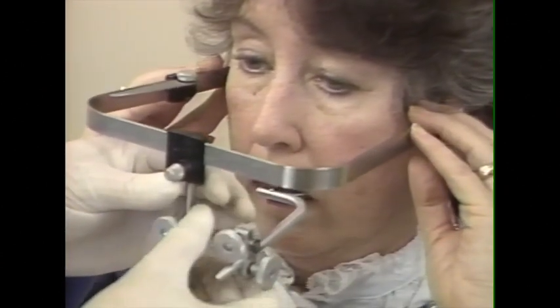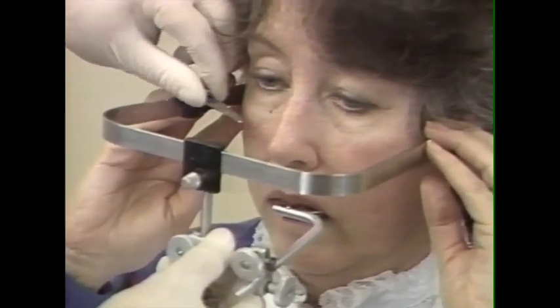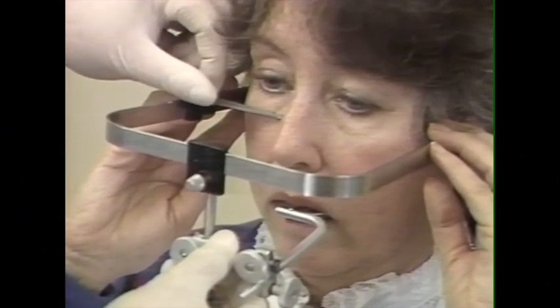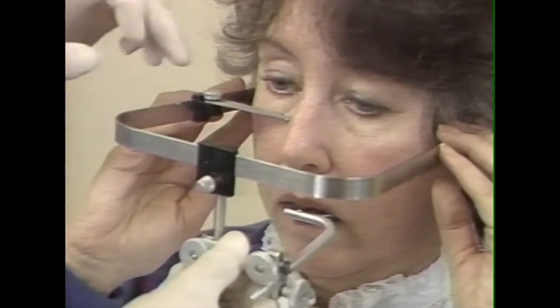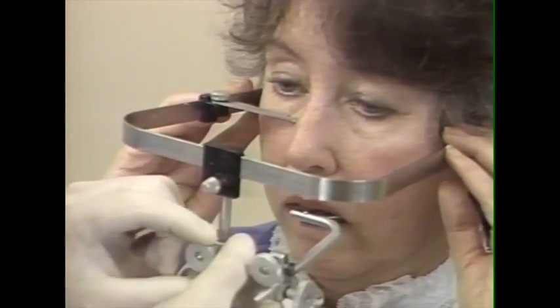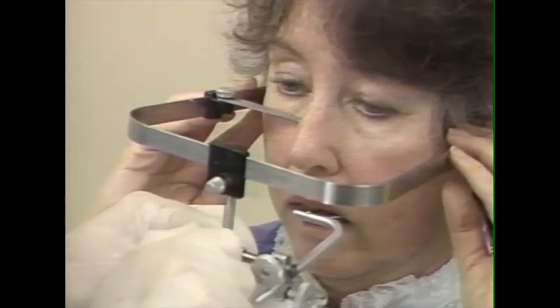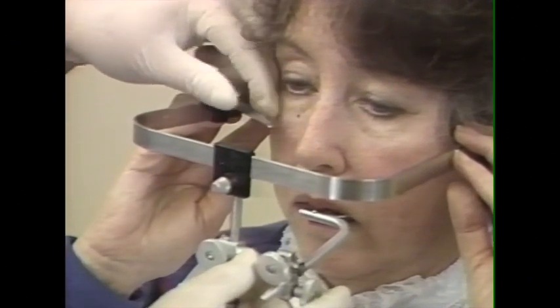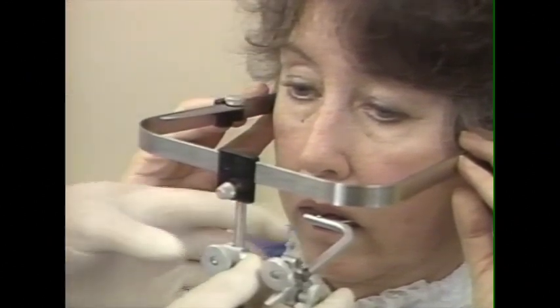And then we elevate and lower the Facebow until we can orient the infraorbital pointer to the axis orbital plane, which is a plane running through the 2 hinge axes and the infraorbital rim. We then need to tighten this number 1 screw at the proper level. Tighten it securely so that it won't slip. We're now finished with the infraorbital pointer, and we can move it back out of the way.